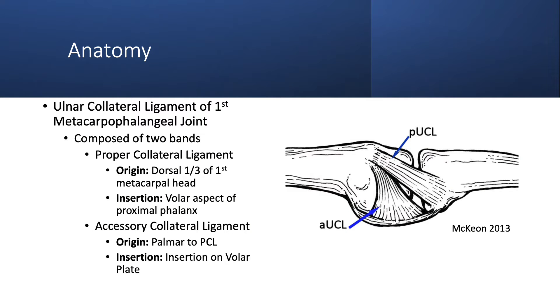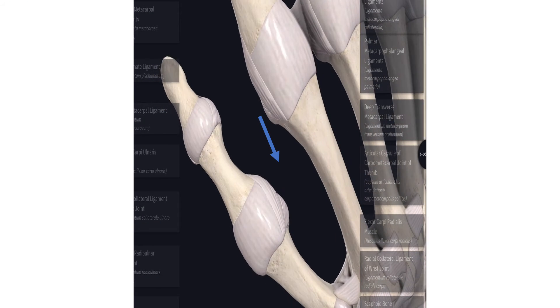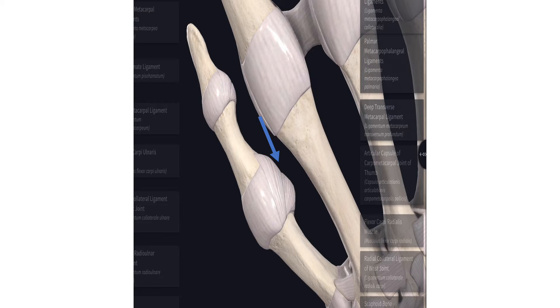The ulnar collateral ligament of the first metacarpophalangeal joint is composed of a proper collateral ligament and accessory collateral ligament. These bands are located on the medial aspect of the thumb, connecting the first metacarpal to the first proximal phalanx, resisting excess valgus forces.